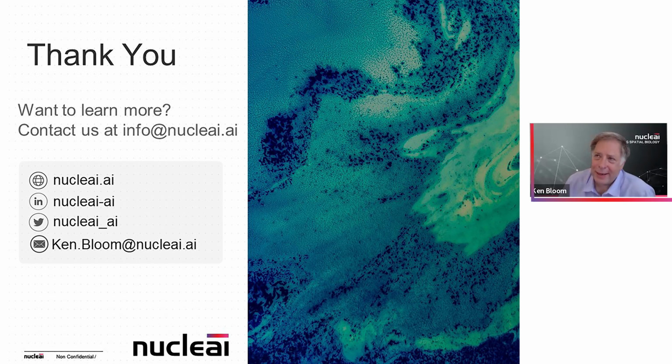Yeah, so I've done a fair amount of annotation. I'll just give you a little anecdote for the pathologists there. One thing people frequently give me is a region of interest on a slide. They say, okay, here's a region of interest that basically fills up my computer screen, and annotate every cell in the field. And the bottom line is, when I get that, I'm super confident on probably about 30 to 50% of the cells. And the other 50% of the cells, I'm not so sure about. It's like, maybe it's a macrophage, maybe it's a fibroblast, because we're not looking at whole cells.